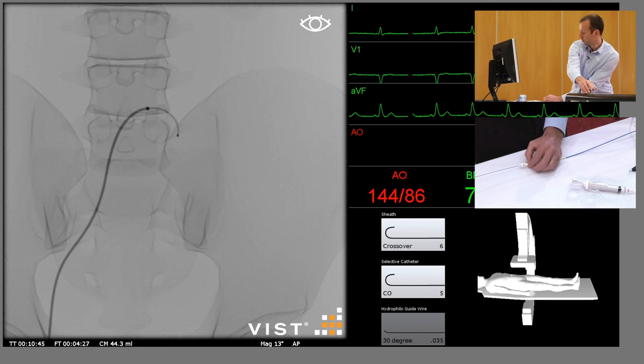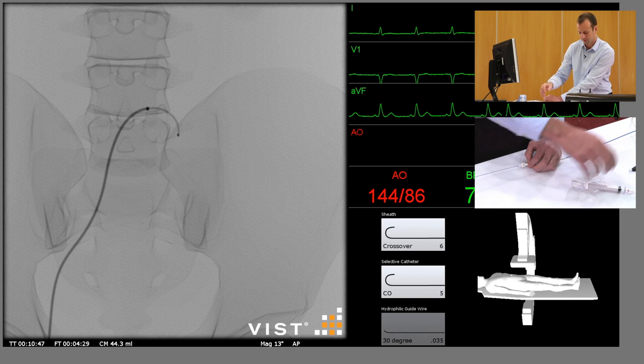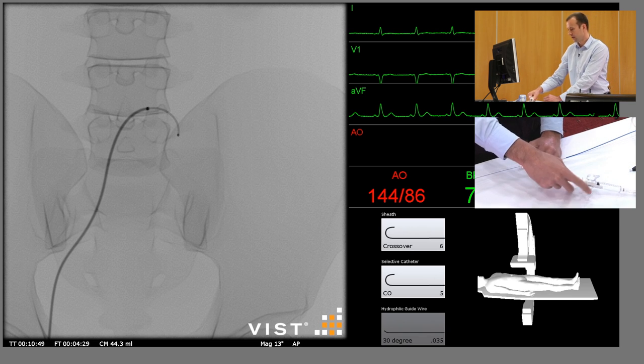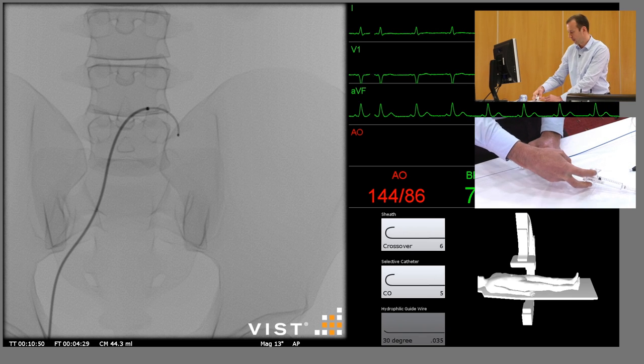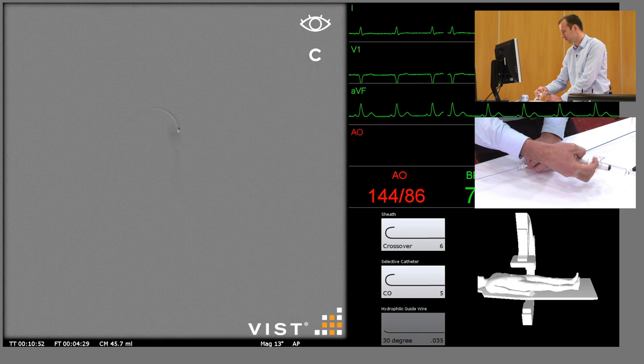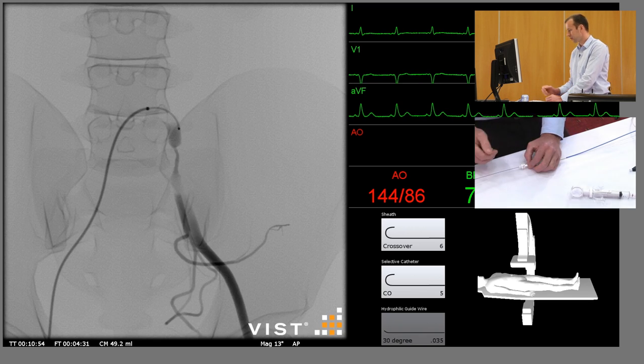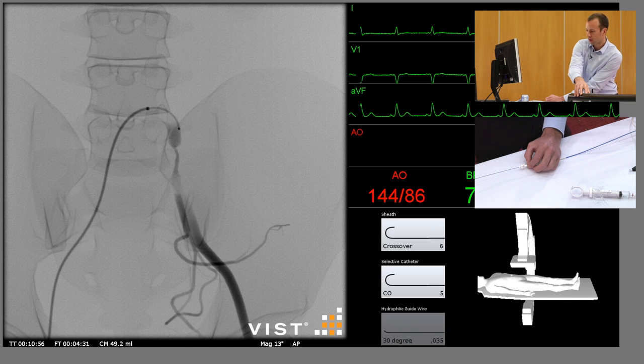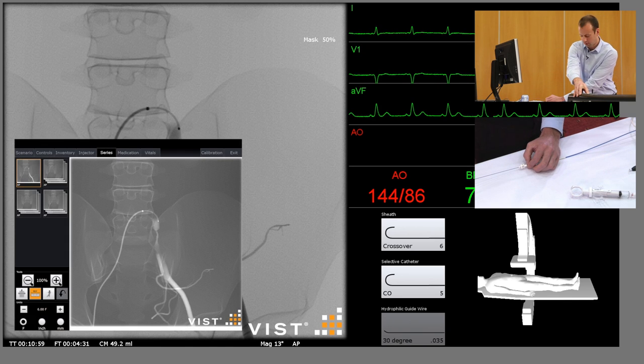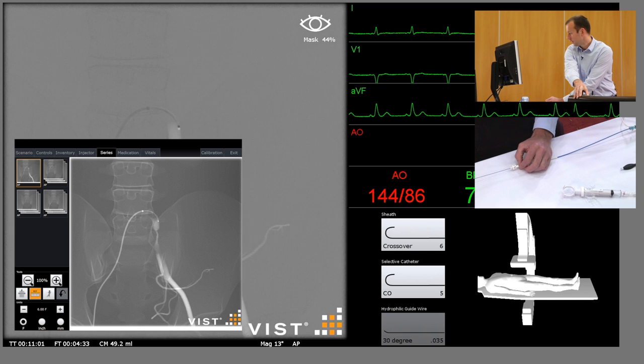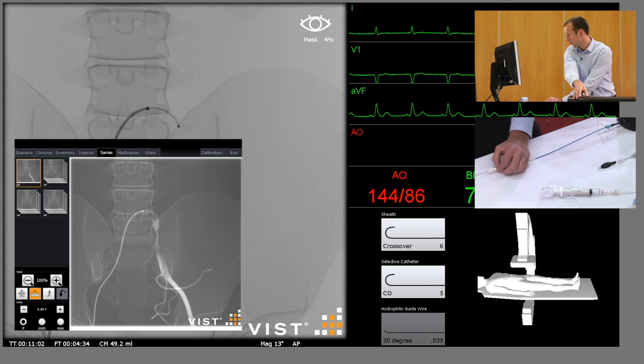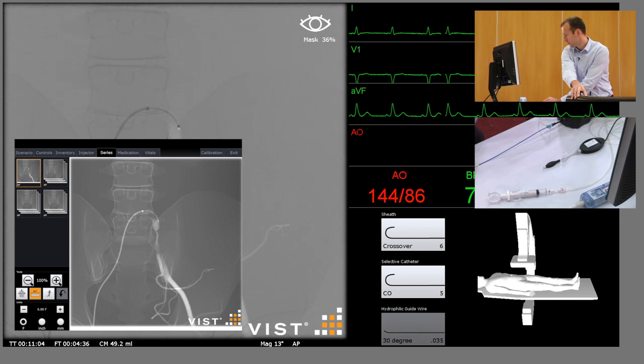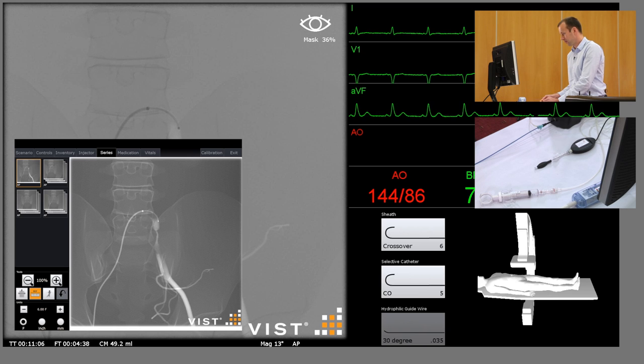We can recenter slightly and do a subtracted run. We can use this to fade in and out over our working image, so we have a map of the lesion we're trying to cross.